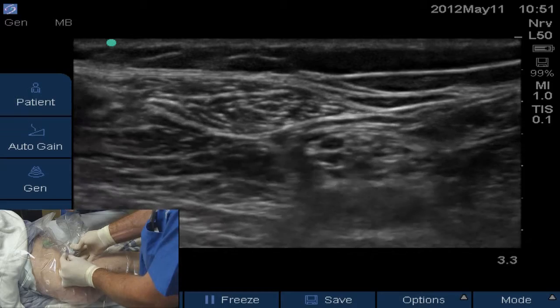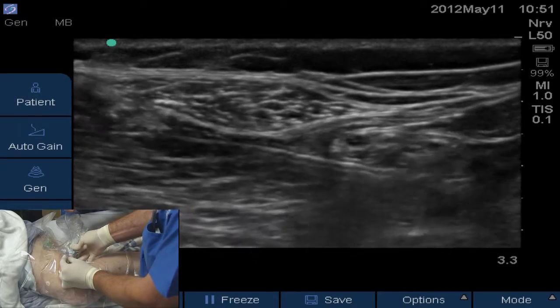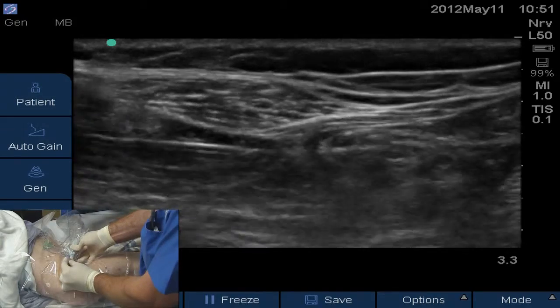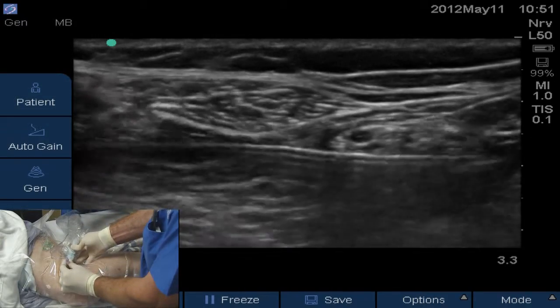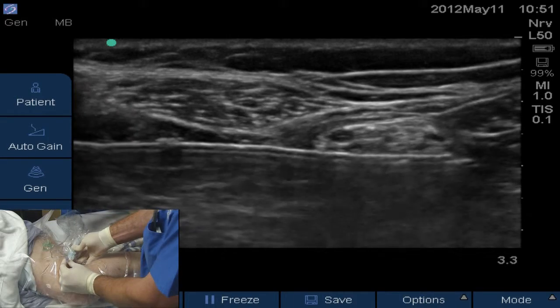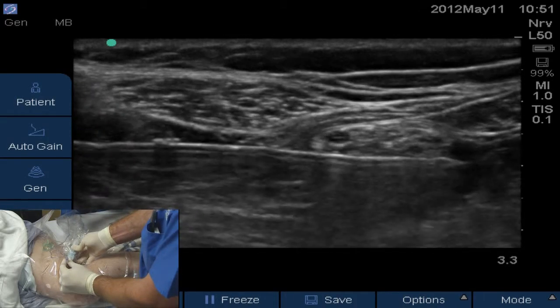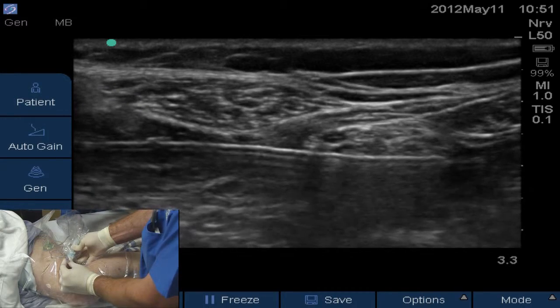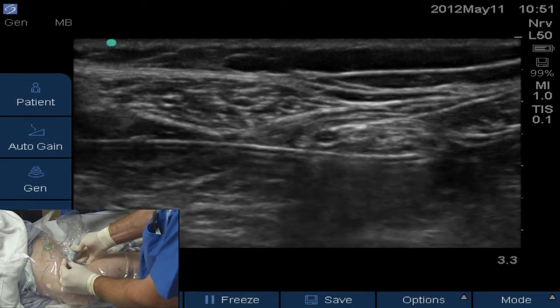You can see immediately, even without intentionally doing it, the local anesthesia has split — peroneal above and to the left of the needle tip, and tibial which is just past the needle tip. So I'm going to steepen the angle to get underneath and past the tibial nerve. Give me 3 cc's there. I'm going to pull my needle back slowly to get the infiltration underneath the tibial nerve.